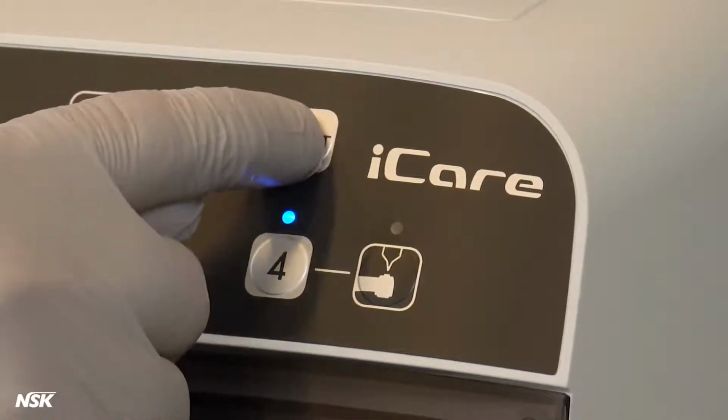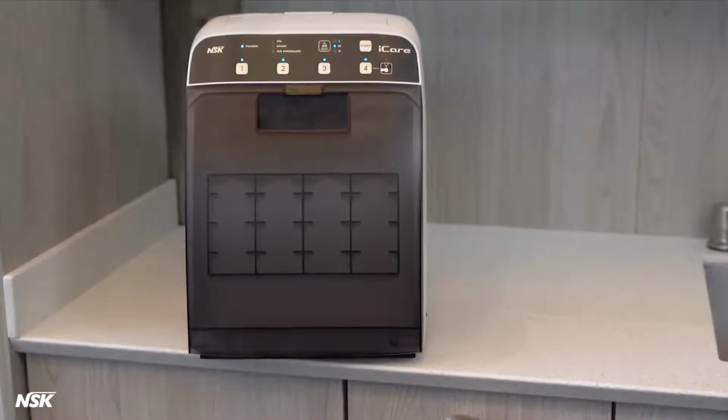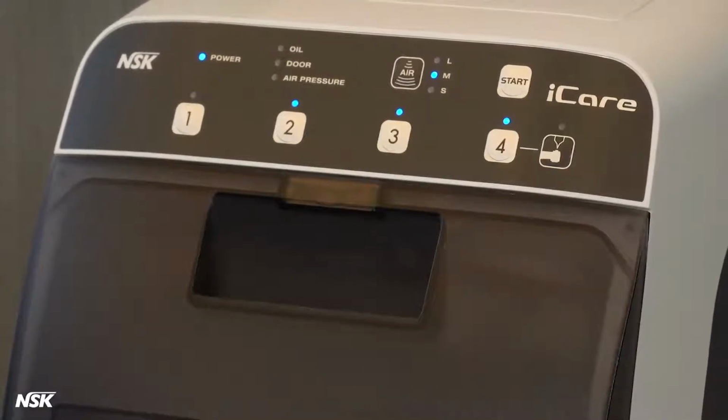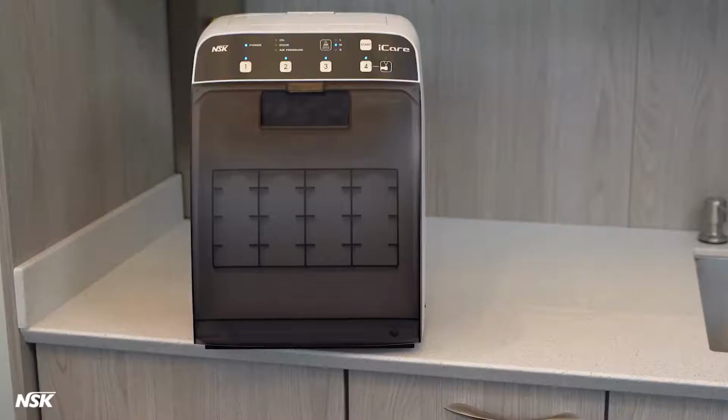Press the start button. You should notice oil mist coming out of the machine during priming. This is normal. This mist only occurs during the priming process and does not happen during normal maintenance. When priming is complete, you will hear a beep and all the lights will turn off.